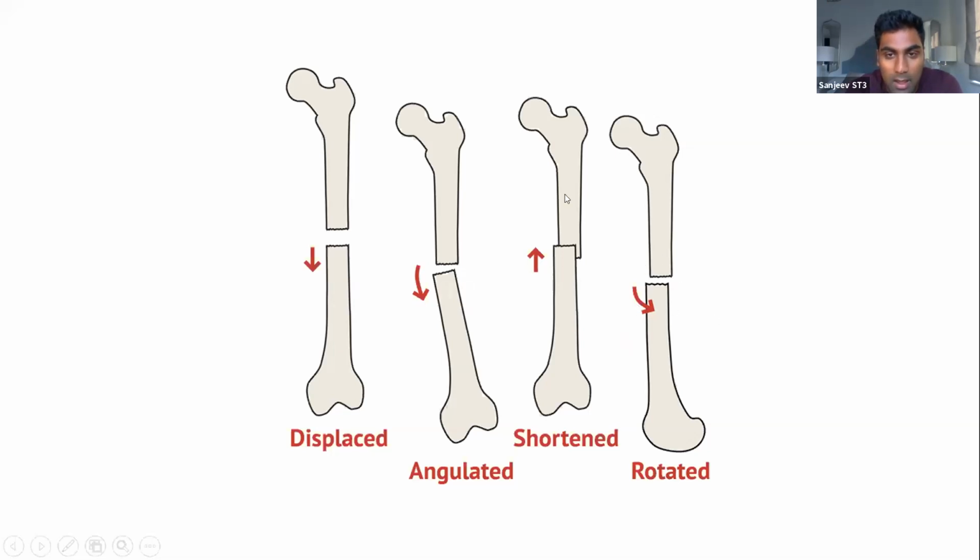But the whole point of going through all of this is they don't want a beautiful 1,000-word description. They just want you to make sure that you go through each of these steps, make sure you've assessed deformity, you've assessed the pattern of fracture, that you've assessed location of bone, and have some kind of attempt at describing it. Okay? Is that all right, guys?